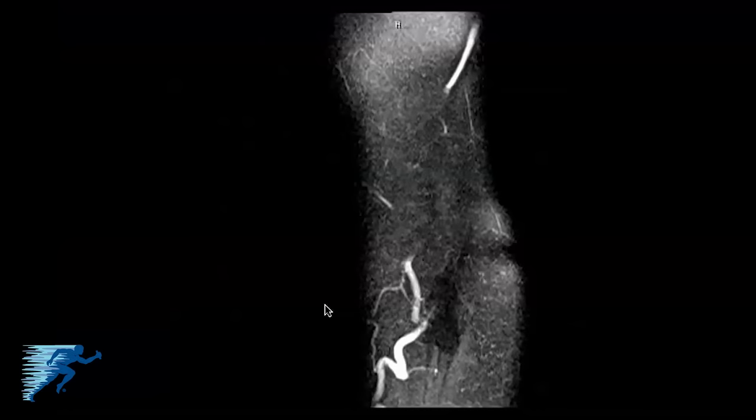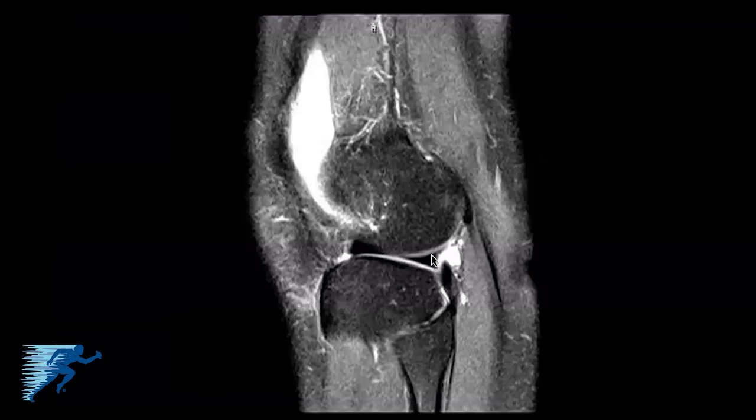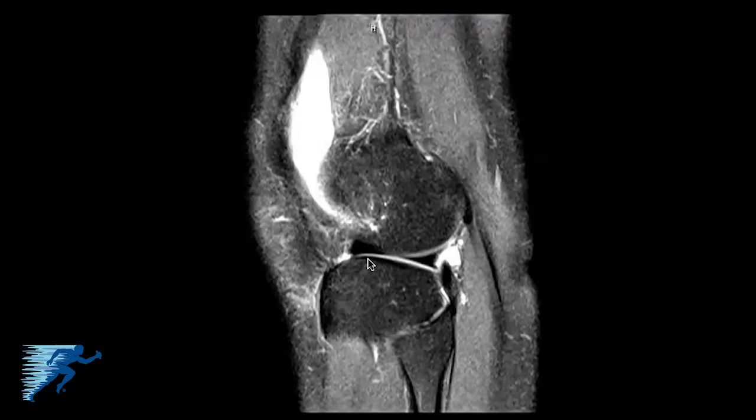The first thing we'll look at is the sagittal view, starting from the lateral side. Here's the biceps femoris coming down and here's the fibular collateral ligament. As we start to go more towards the midline, we'll start to see the lateral meniscus come into play — this is the lateral meniscus here.